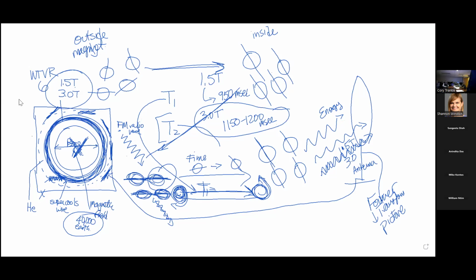And so that's why you're going to see stickers: MRI safe, not safe, and so on. So you will see metal go in there, and you're going to be confused. Well, non-ferromagnetic metal can go in there, okay?